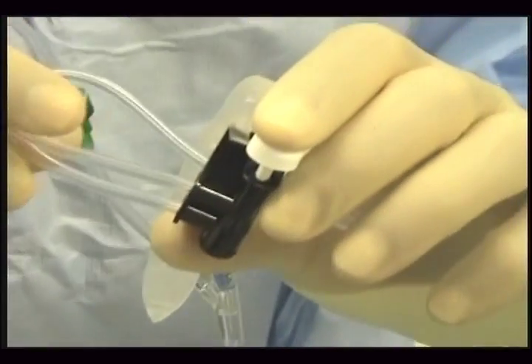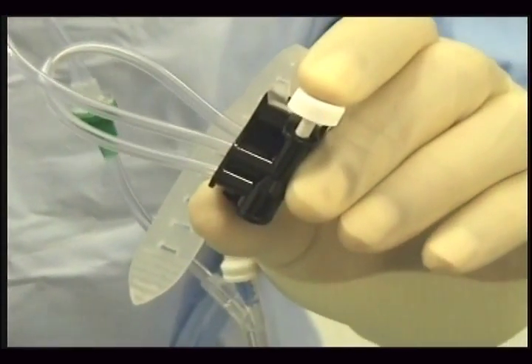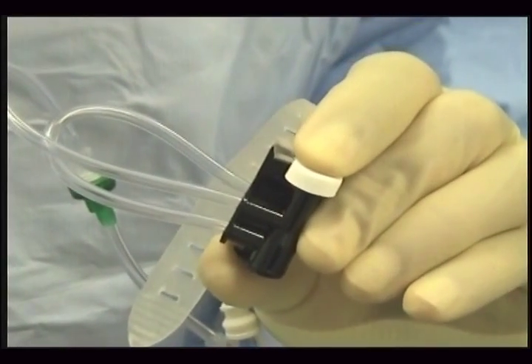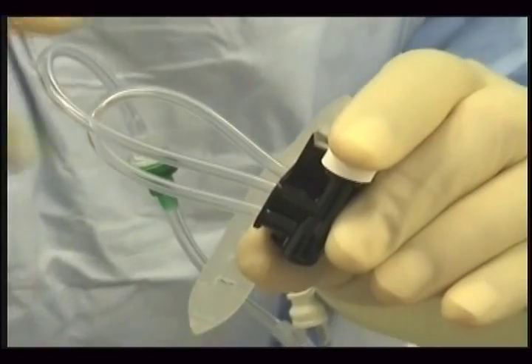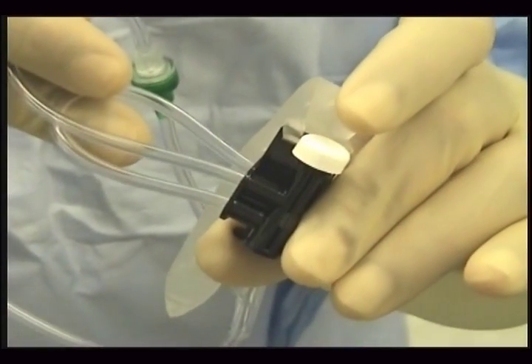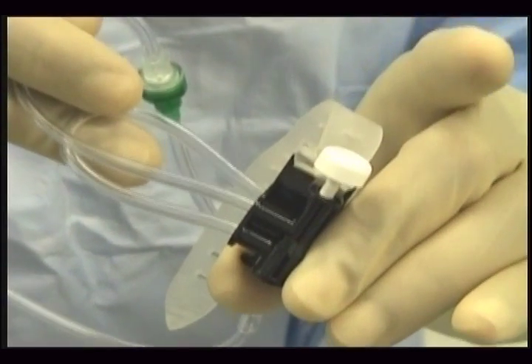The control of flow is from the actuator button like so. It can be controlled drop by drop to a full flow, and when it clicks, if you let go of the hand, it will remain open. And when you want to stop it, you click it again and it will stop.